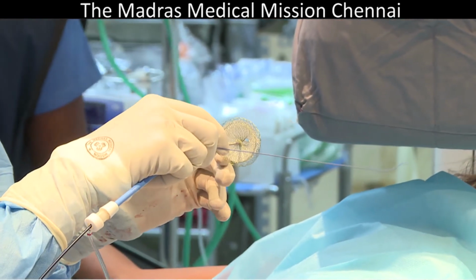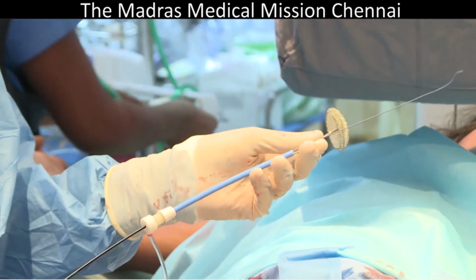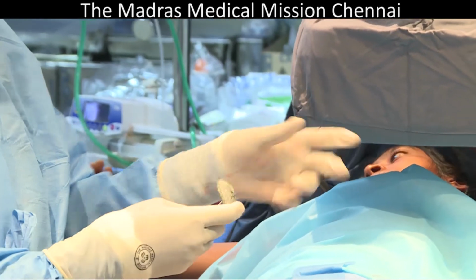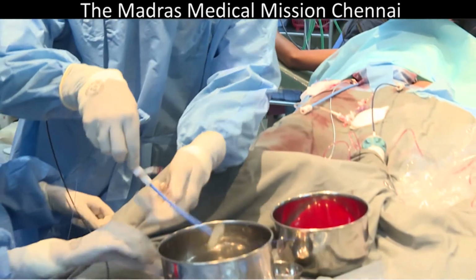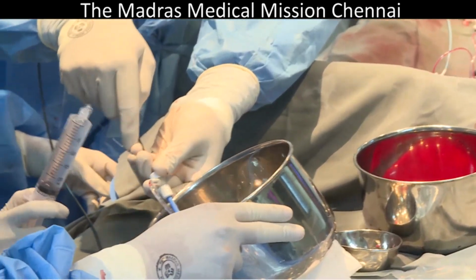So you're loading a wire alongside the device, yes? Correct, in order to get the fenestration coaxial after we get the device across. So now this goes inside. Okay, so I'm going to load it underwater. Yeah, splash it, Srija.